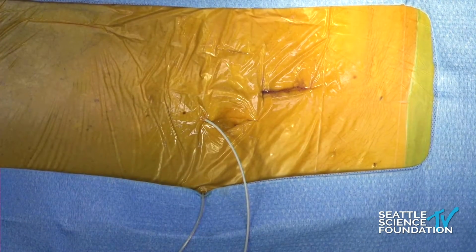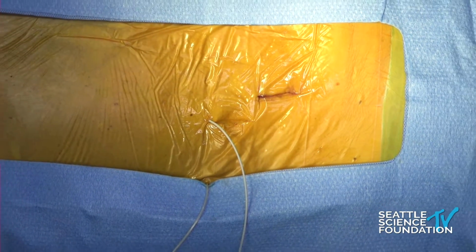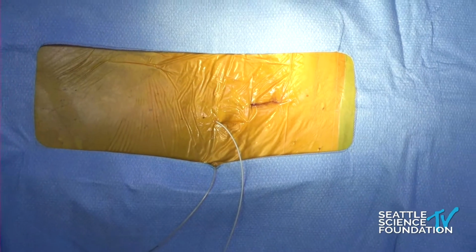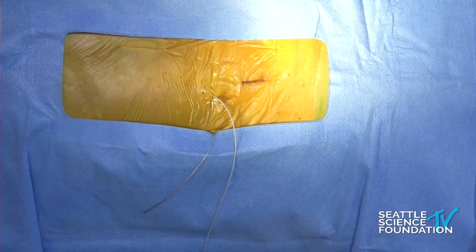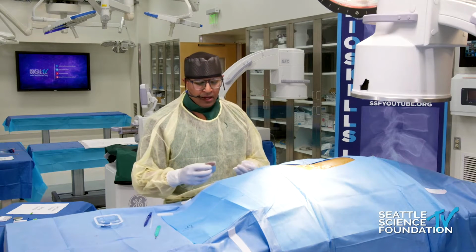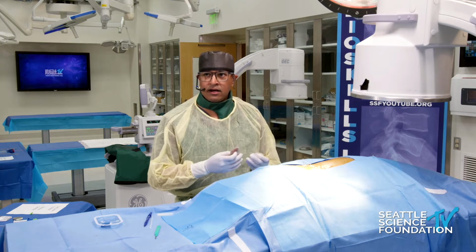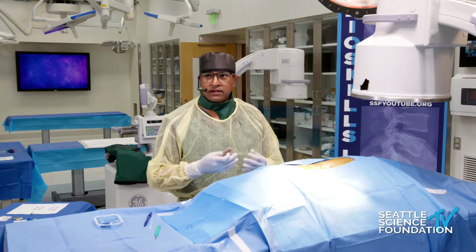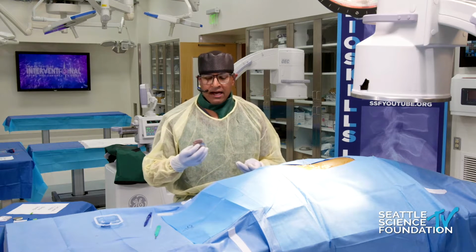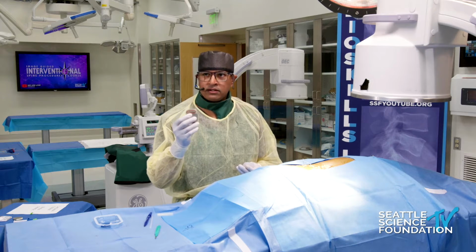So what we're going to talk about today is a new entrant into the spinal cord stimulator market, and that is Biotronik. They are a German company, and as you probably know, most of the spinal cord stimulator companies are American. So it's nice to have, again, some competition. Really, the hardware is no different than what you've already heard from Dan with Medtronic and Boston Scientific. The leads are relatively similar. The IPG, the idea of screwing the leads into the IPG, is relatively similar.